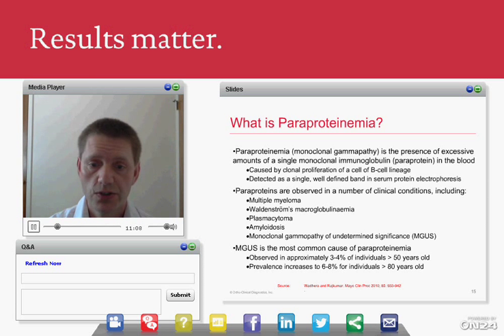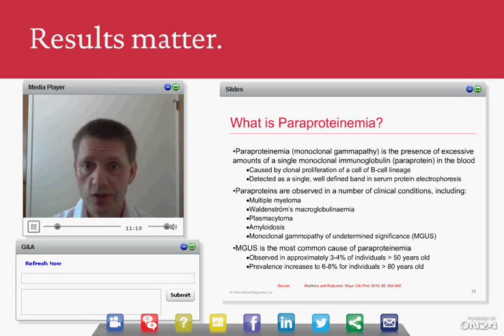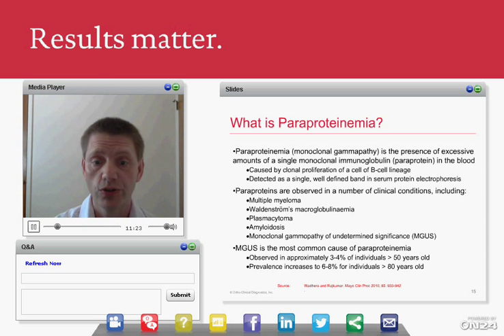So the individuals that you would be more likely to worry about, in general, in terms of chemistry assay results, because there's a higher probability of them being incorrect, those individuals are also the most likely to have this type of interference.